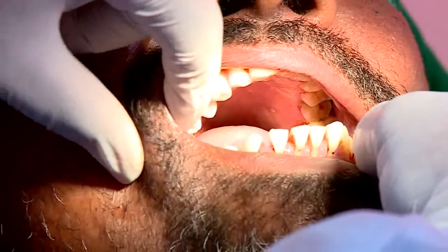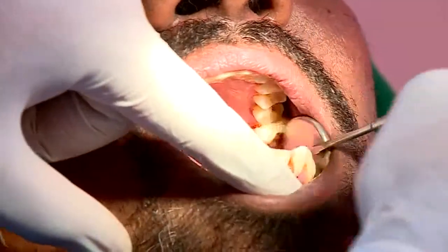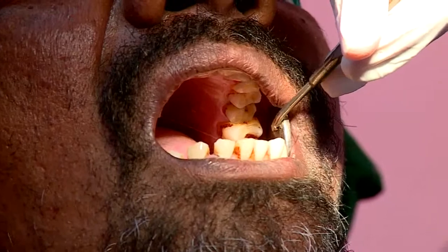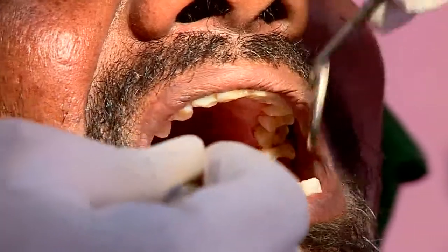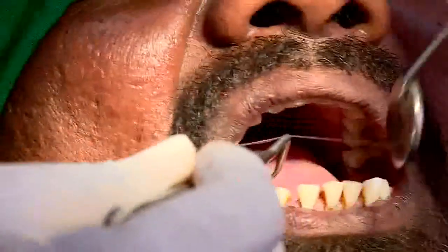Once we finish with this, we have to examine the retromolar area bilaterally. Again, mouth opening is a difficulty. Are you able to see this area, the posterior area? Yes, the retromolar area, the instrument is pointing at that. The retromolar zone is also extremely blanched and fibrosed. That is an important reason why the patient is having limited mouth opening. Are you able to see? The retromolar area we are not able to see. Okay.